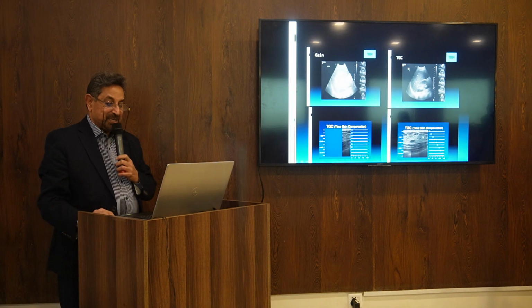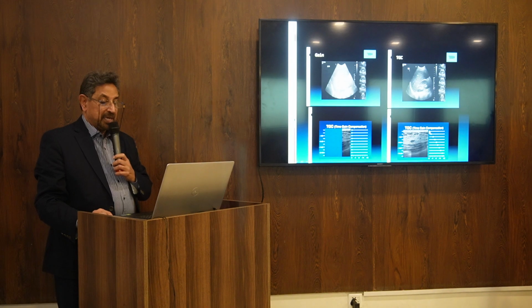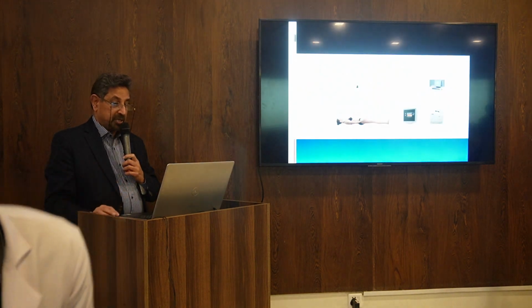So the echoes coming back from the nearest part should get minimum compensation. The farthest part should get the highest compensation to get a good image, a good impression. That is very important. Get a good picture.